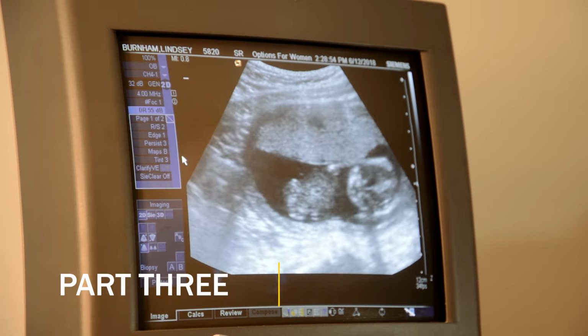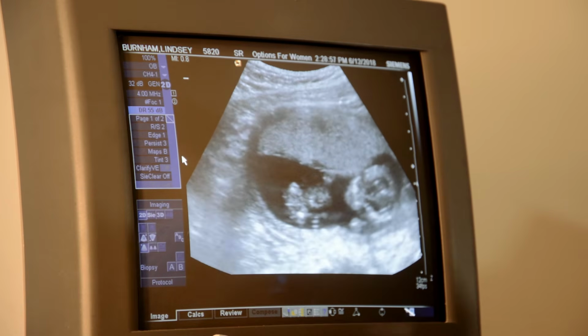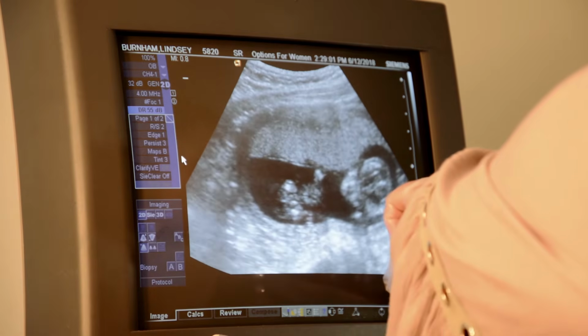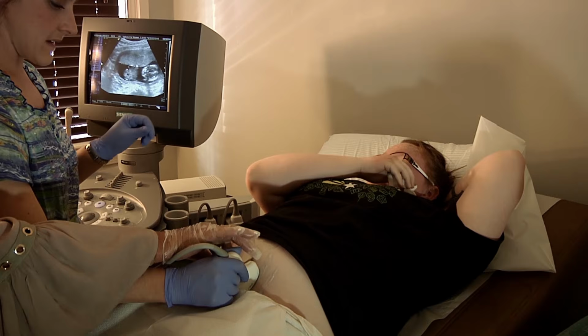Sad, but originally I was confused as to head after down. Okay, so the head. This is inferior. This is superior.